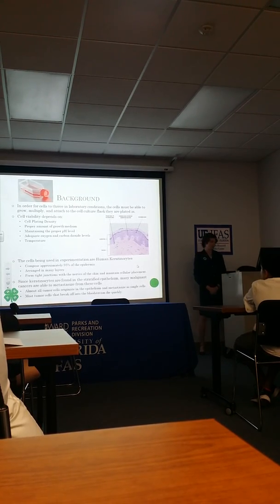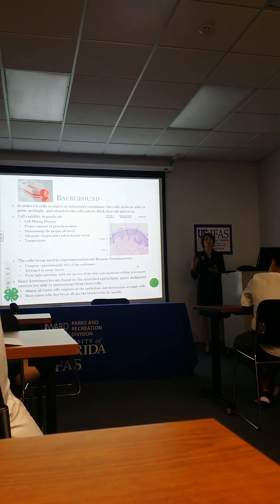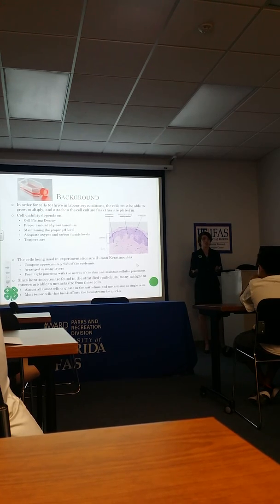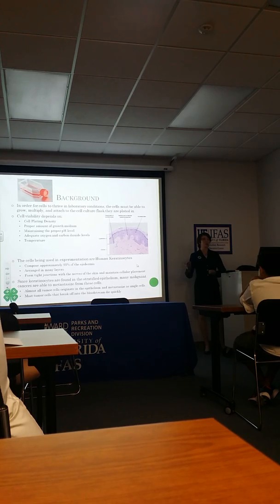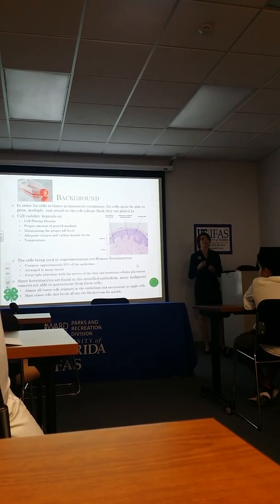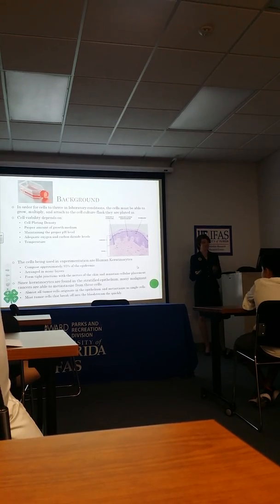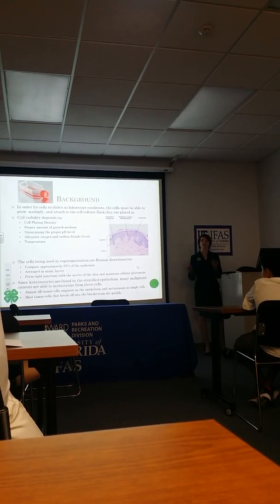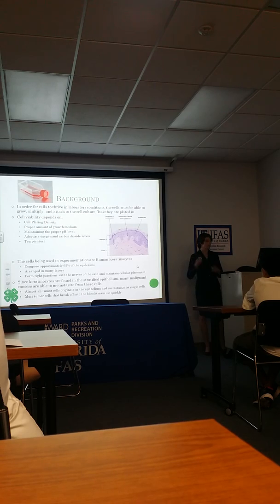The cell viability, or the ability of the cells to actually grow and thrive, is dependent on the plating density of the cells, which is the number of cells per square centimeter in your cell culture flasks, the proper amount of growth medium, which is supplemented with agents that allow the cells to grow, maintaining the proper pH level, which is necessary for adequate oxygen and carbon dioxide for the cells, and of course, the temperature of the cells, which is 37 degrees Celsius in an incubator.